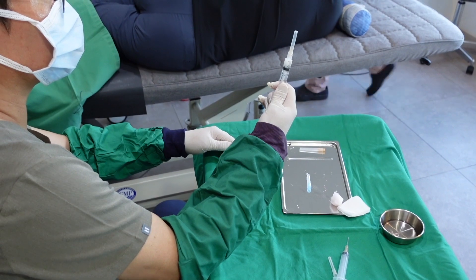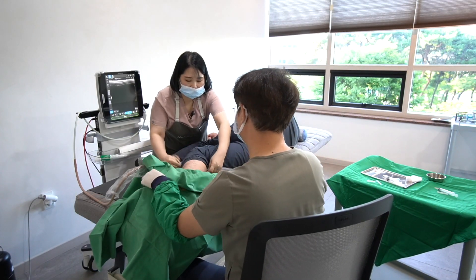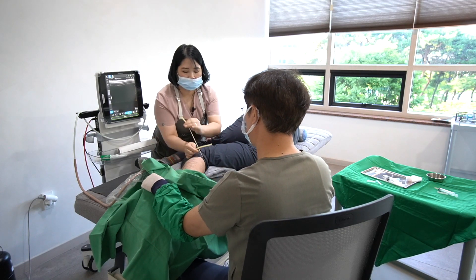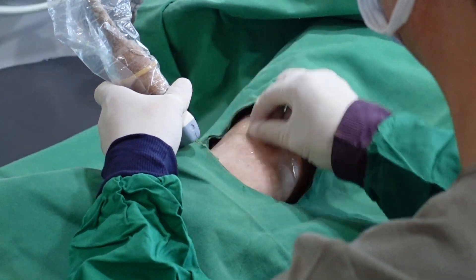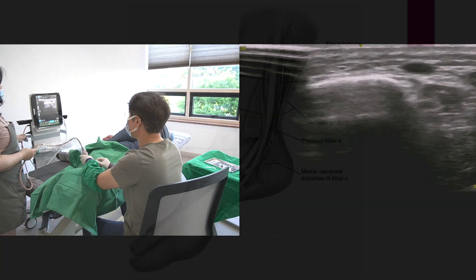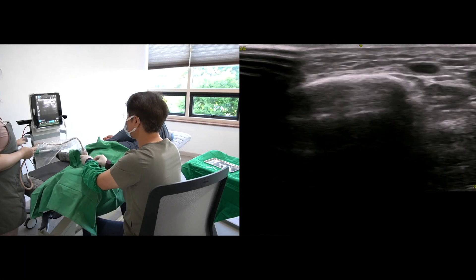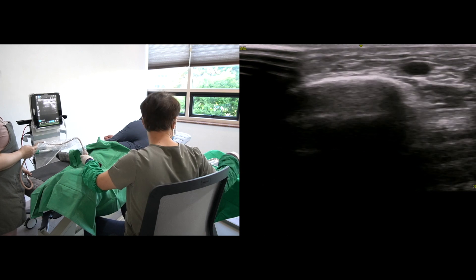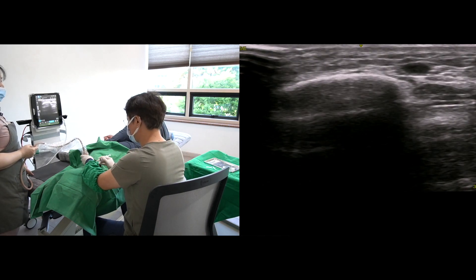I connect a 1-inch 26-gauge needle for venous blood draw. The next target is the great saphenous vein. The vein is located on the superficial fascia of the medial aspect of the tibia. It is a prominent example of the saphenous vein, but it is not always easy to draw blood under ultrasound.